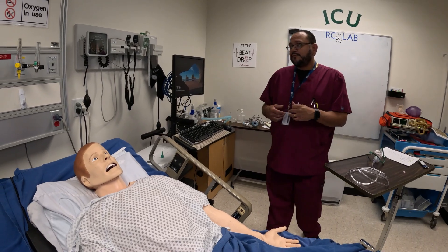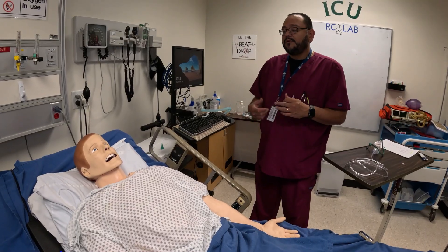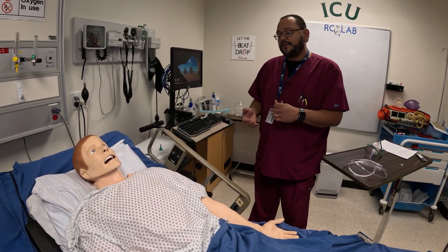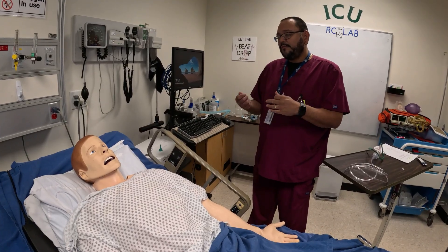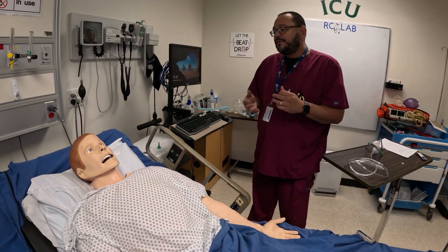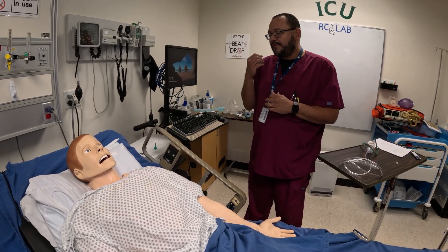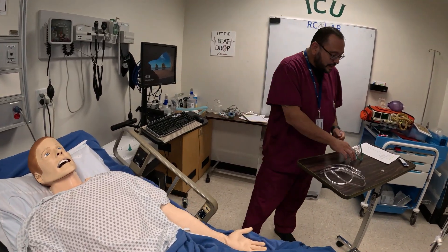So, Mr. Smith, would you prefer — or have you had breathing treatments before in the past? If he says yes, I do them all the time, great. If he says no, I'll explain to him exactly what we're going to do. So, Mr. Smith, this is going to be a small mask — I can do a mouthpiece if you like. It's just going to sit on your face for about 10 to 15 minutes and it's just going to be a fine mist. You're going to breathe in and out through your nose or mouth. And I'm going to go ahead and put that on him now.